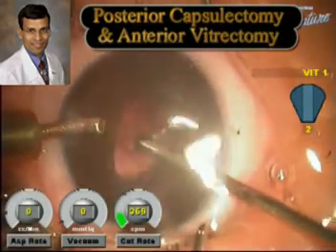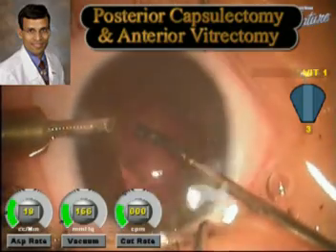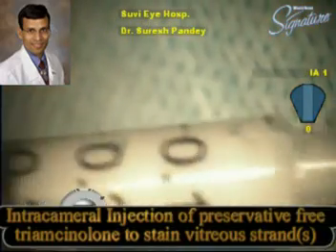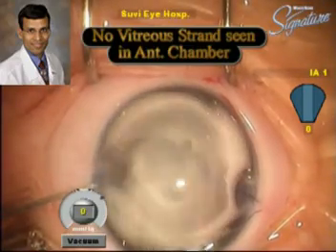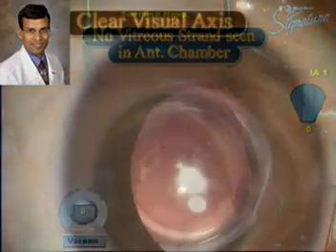Here, anterior vitrectomy is being performed after implantation of the IOL, and in small children below the age of 5 years, this is important to do. Especially after an anterior vitrectomy, it is extremely important to inject intracameral triamcinolone into the anterior chamber and carefully remove any vitreous that may be present.